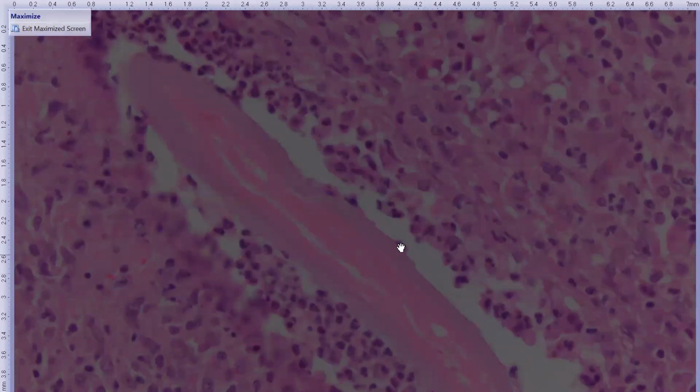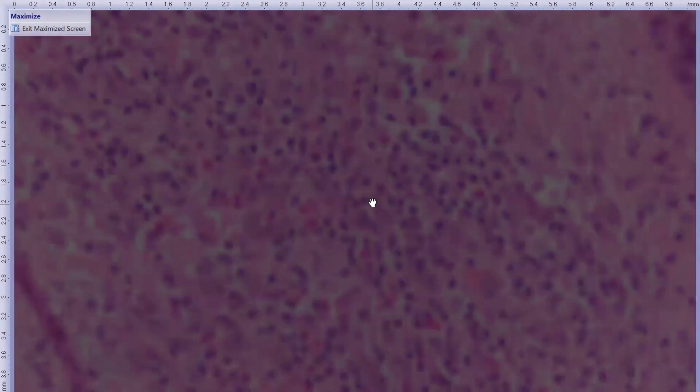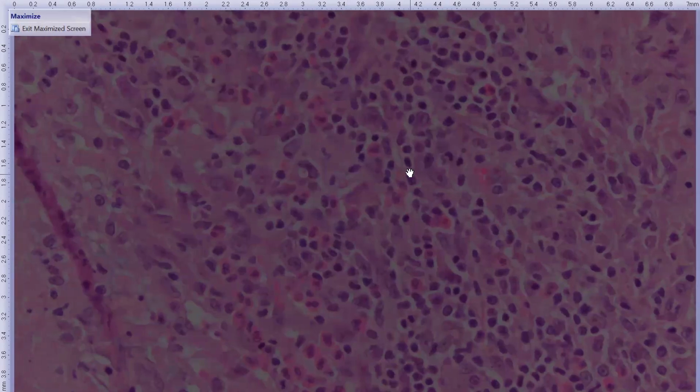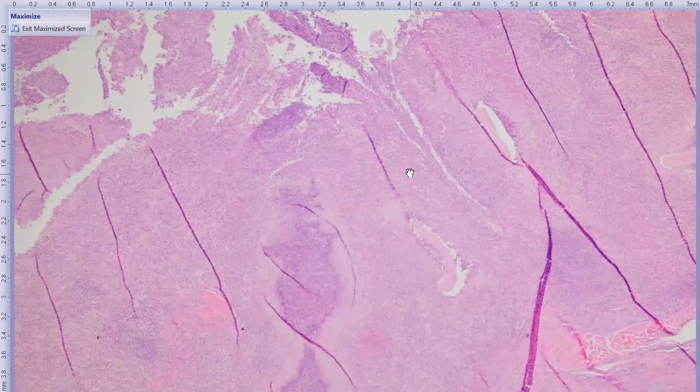So I interpreted these as cuticular ridges, and they seem to be running around the girth of the worm. So annular cuticular ridges. The inflammation that we have around them is granulomatous. So we have a bunch of macrophages here, and then right around them are some neutrophils. And then in some areas, if we go higher mag right there, all of these guys with the bright pink cytoplasm are eosinophils. So we have an eosinophilic granulomatous, and then all the smaller nuclei around here are lymphocytes and plasma cells. So an eosinophilic granulomatous and I guess suppurative as well, and lymphoplasmacytic orbital cellulitis that is surrounding nematode parasites.